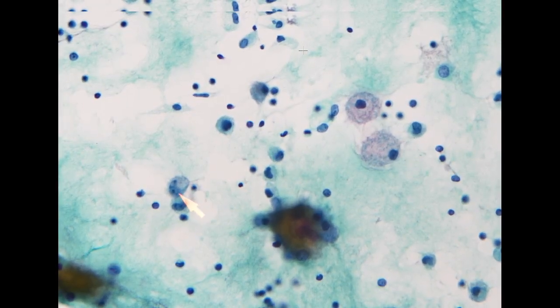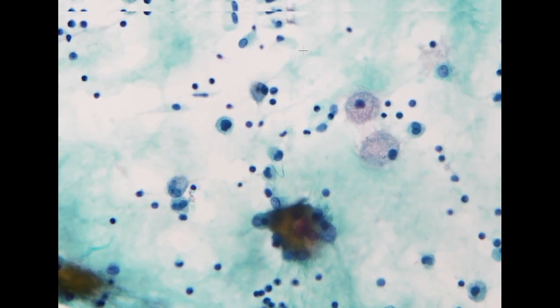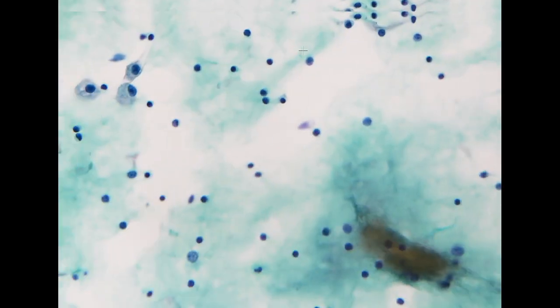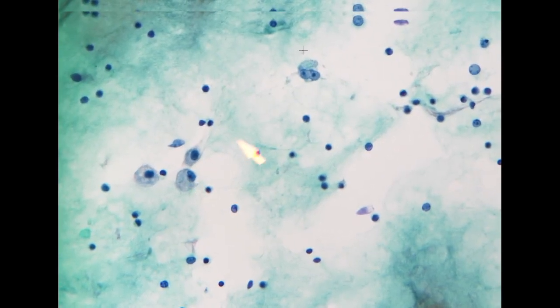However, you can still identify some of the cells definitely show very atypical nuclear features. So this specimen is still considered positive for adenocarcinoma and compatible with the patient's prior history of gastric cancer.